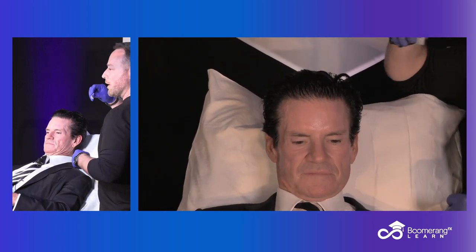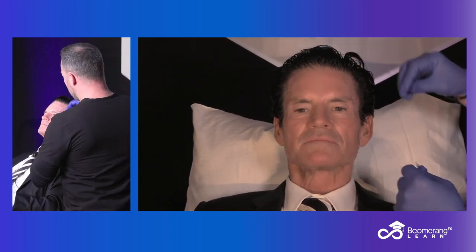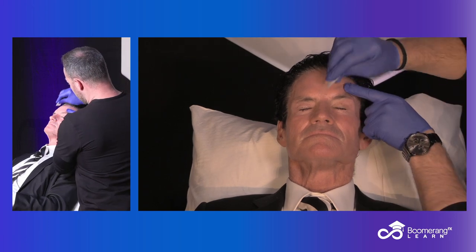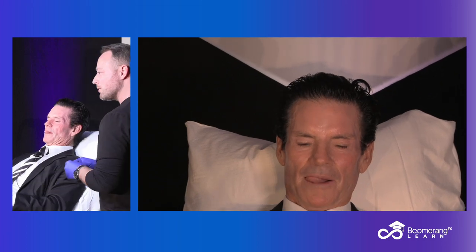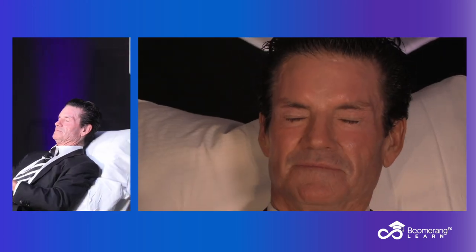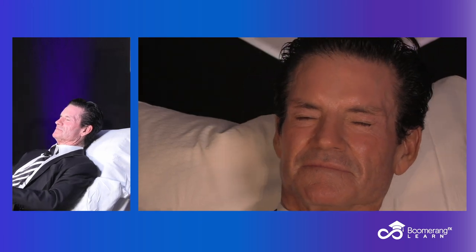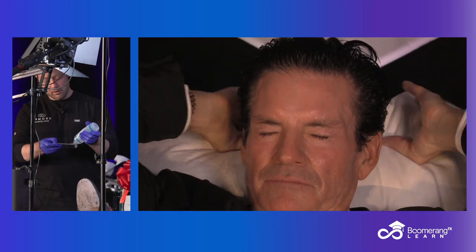Essentially, just get your patient leaned back in a comfortable position so you can see what's going on. Always wipe with alcohol to get any residue off the skin — Dr. Mulholland has very natural, young-looking skin and I'm sure he's compliant with his skin care regimen. He stops his skincare two days before every treatment. Then, applying a little bit of clear ultrasound gel to the treatment area. We're going to start on one side of the face, treat one eye — upper and lower — for about four to five minutes, then switch to the other side.